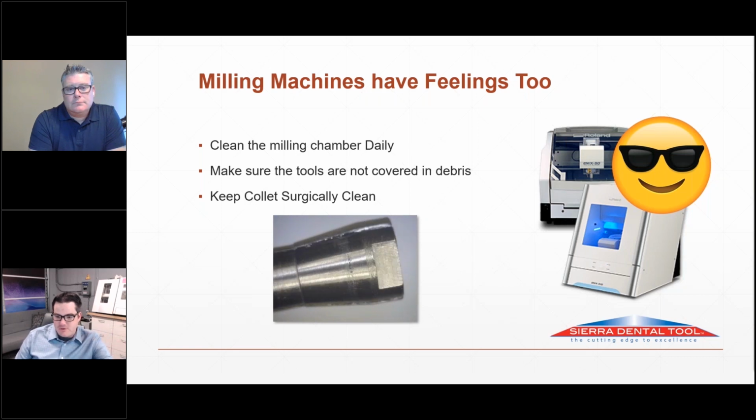What it does is it fails to do those two things. It doesn't hold the tool on center. That wears tools out way faster. And it doesn't hold it securely. You'll get tools slipping out and breaking. It basically is responsible for creating a lot of the milling issues that come up on tech support lines. And so by just implementing a good procedure for keeping the collet clean, you'll eliminate all that headache. It's super easy, low-hanging fruit stuff to do.